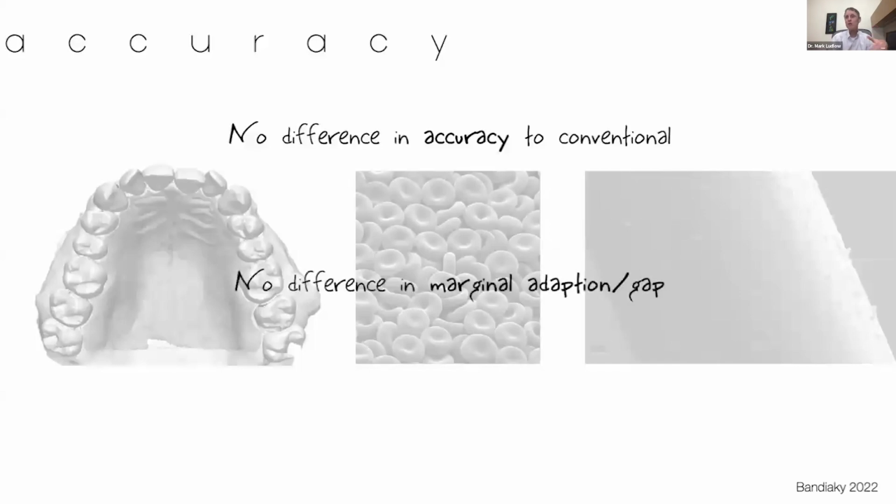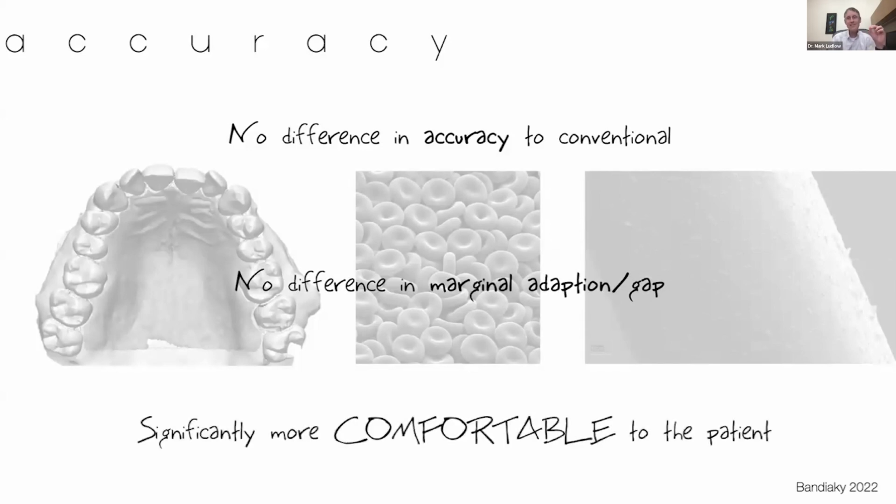You see this, what you can build off of this, all your restorations, no difference in marginal adaptation or marginal gap. But what you always see in these studies, and again, what I mentioned at the very beginning, is that it is significantly more comfortable to the patient. Okay, the patients usually prefer the scan significantly more than impression material. So again, our data shows it, the systematic reviews show it. These are the things that we should not be fearing.